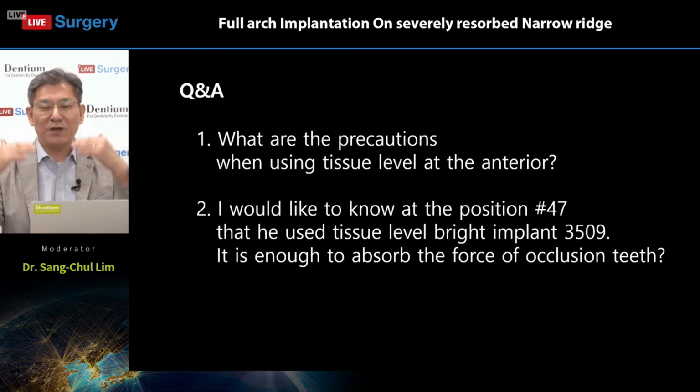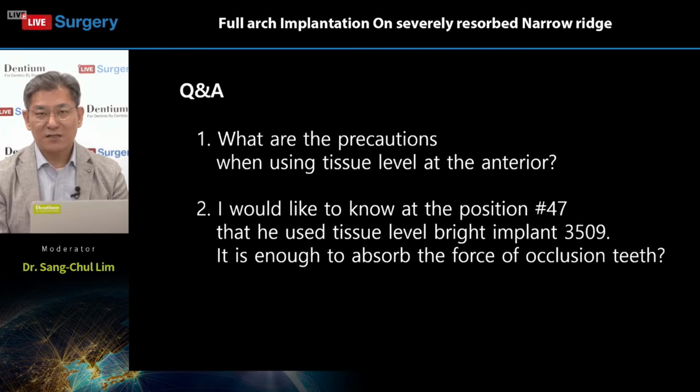So a little bit deep insertion is a necessary part and my suggestion for you.